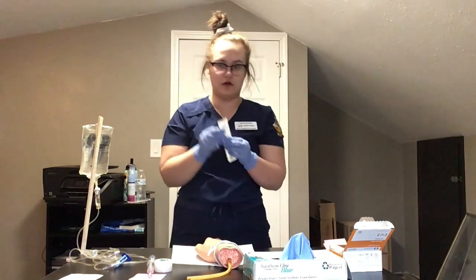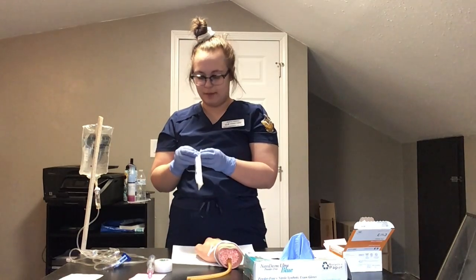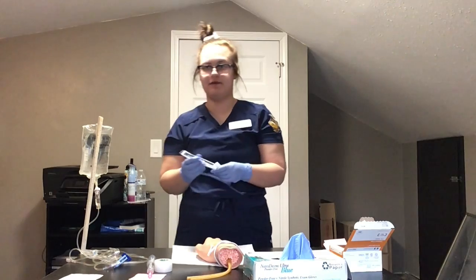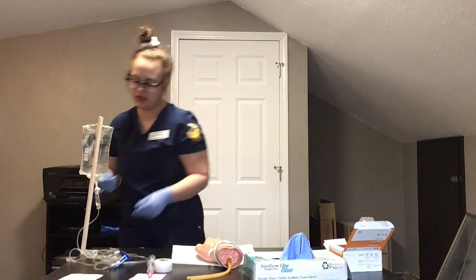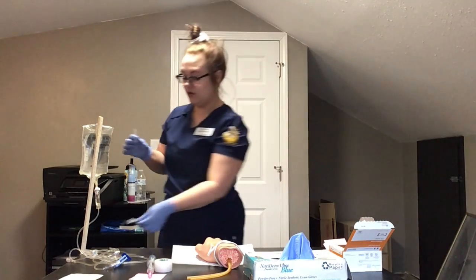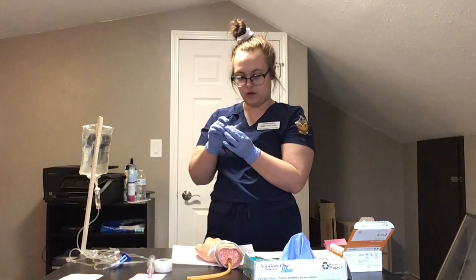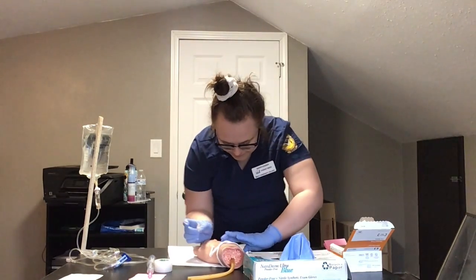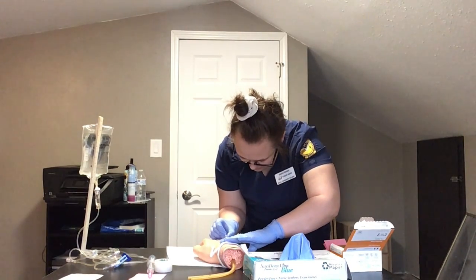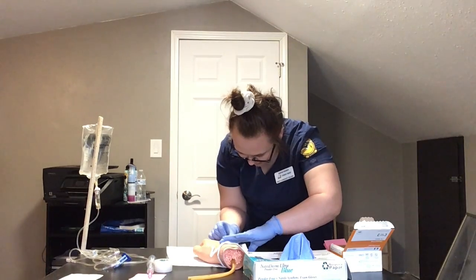Okay, I've got my vein, so now I'm going to get my catheter. And I would choose the catheter based on my patient, their age, the type of IV solution I'm going to be using, and the infusion rate. I'm going to take the cap off. I'm going to make sure not to touch the needle, bevel up. I'm going to hold it with my thumb and my forefinger and hold the skin.